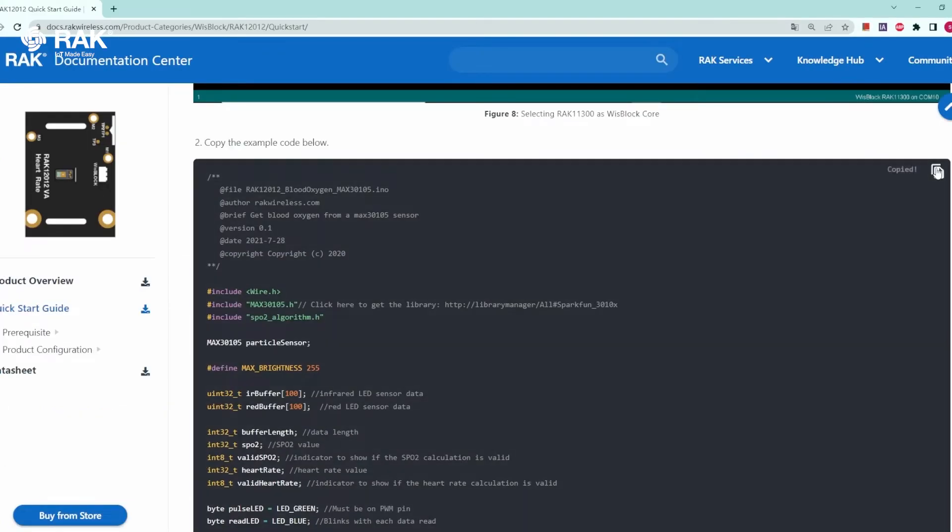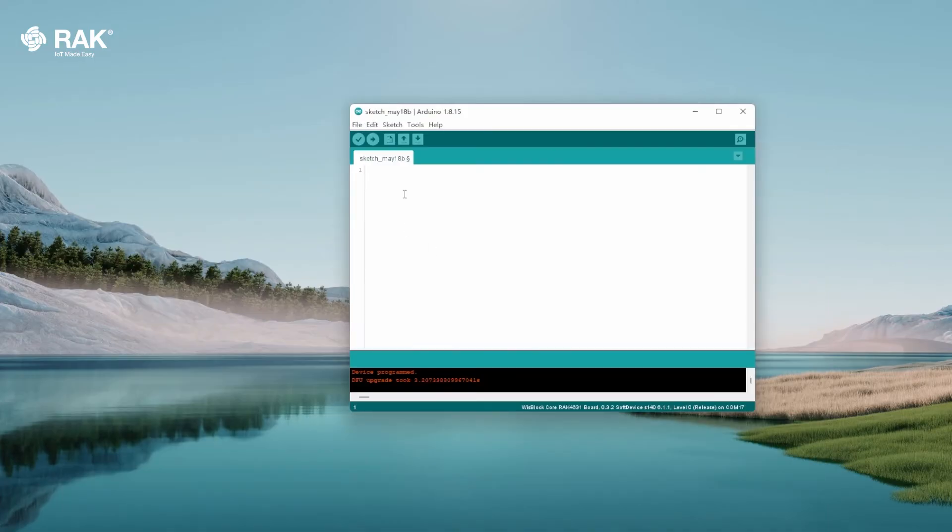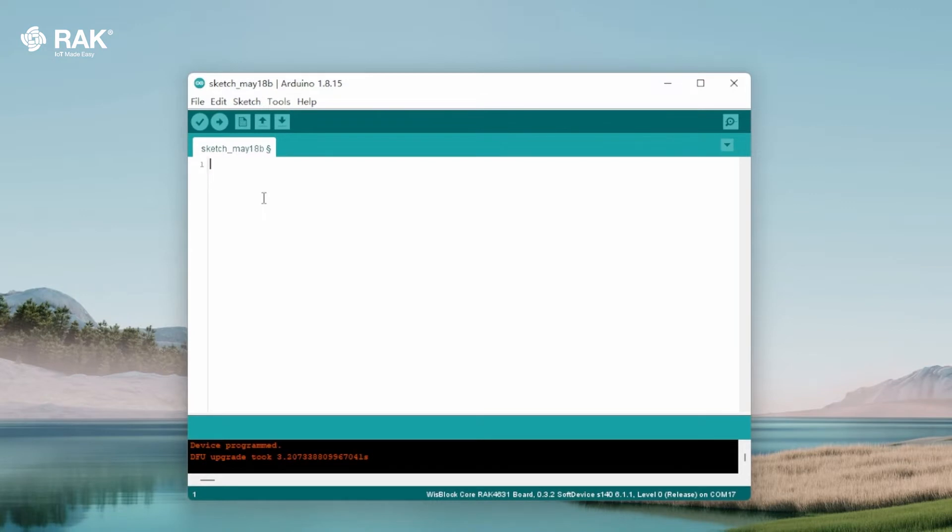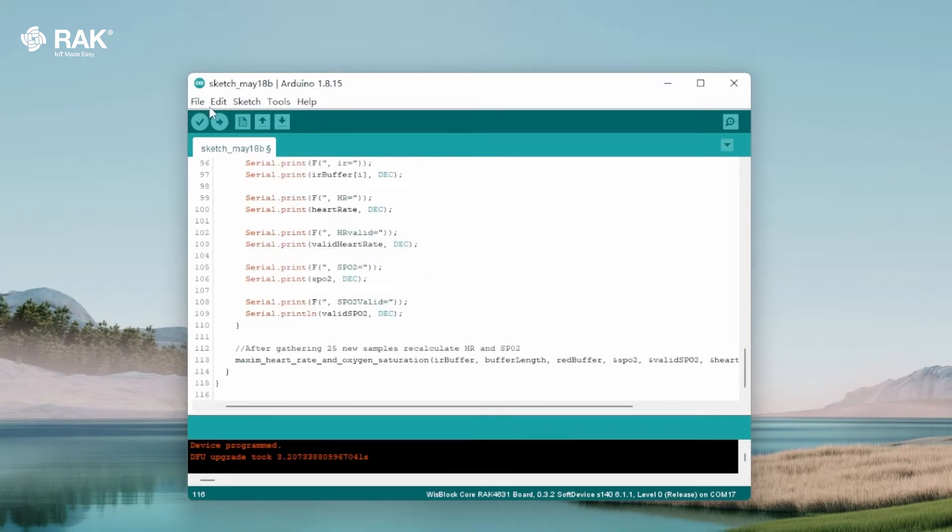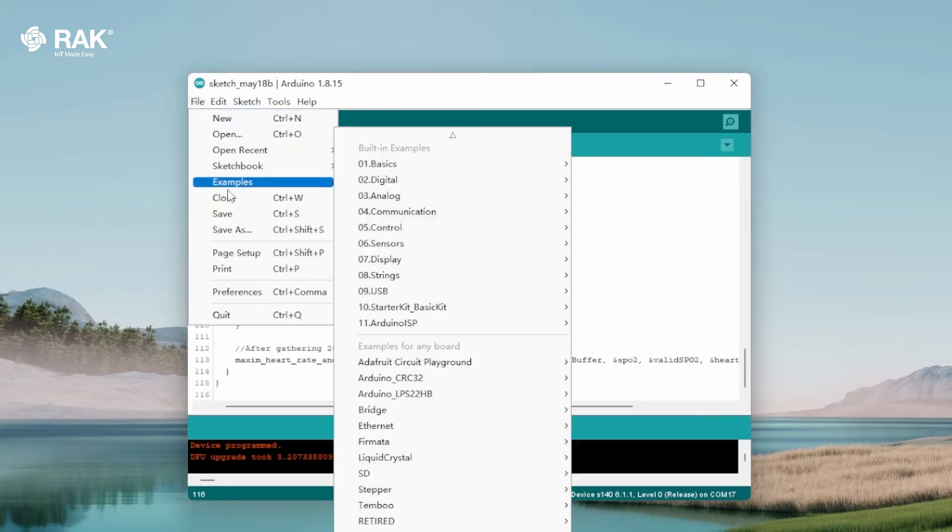Scroll down to sample code and copy. Go back to Arduino and control paste. Then go to file and select save.